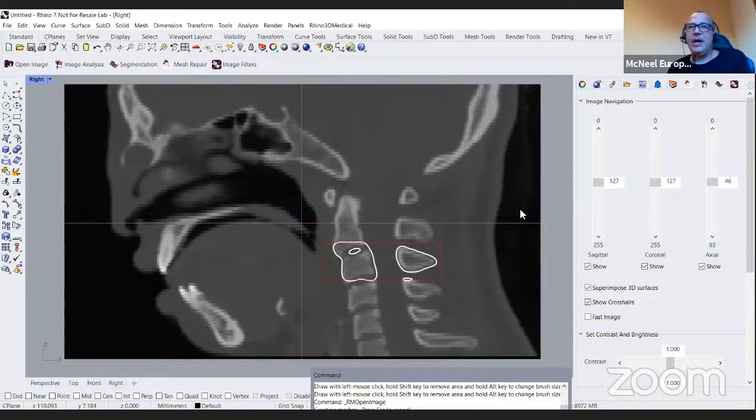Now, Mauricio Morinigo. Hello, Pablo, how are you? First, congratulations, excellent presentation. Could you design this pedicle-based transverse process to serve as a support for the structure? He's asking if you can use this for preoperative planning, for example. I think so, yes, as a support.